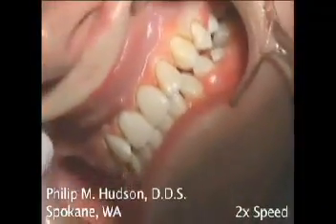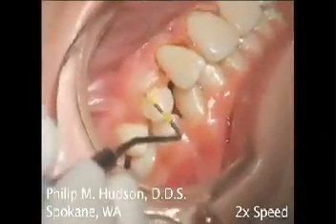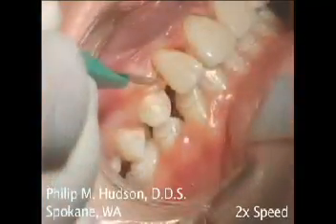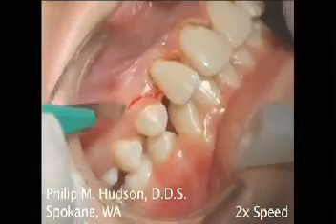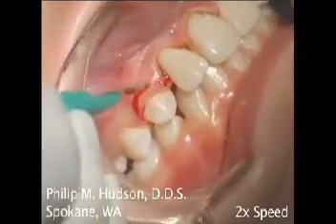For purposes of illustration, it is easy to see how the laser improves the surgical field after initial removal of gross amounts of tissue with a scalpel. Under normal circumstances, a scalpel would not be used during any portion of this rather extensive procedure.